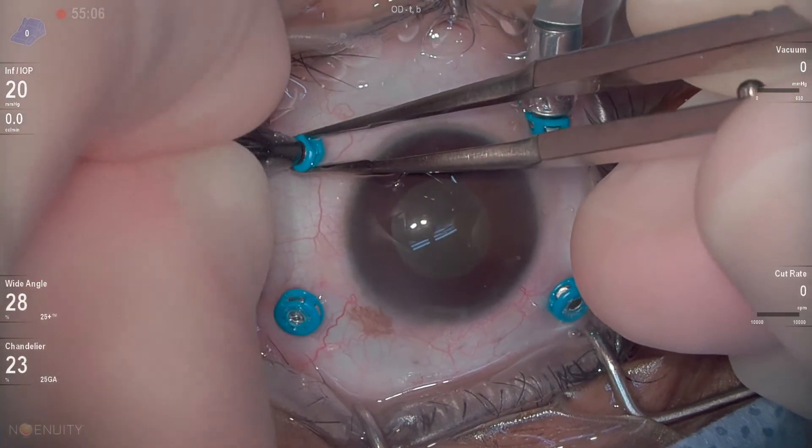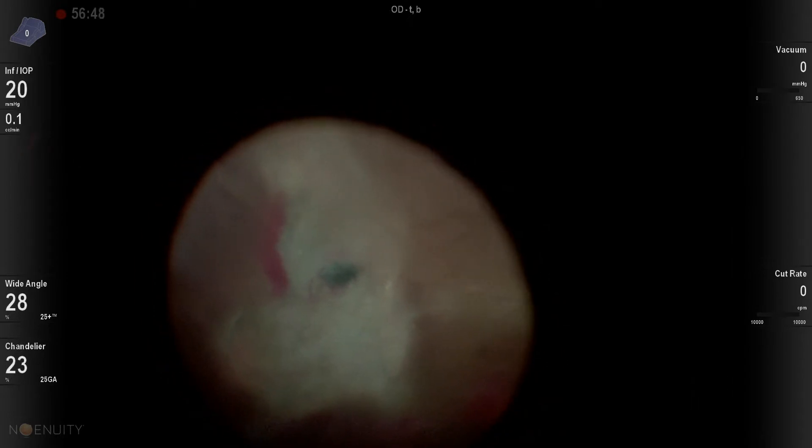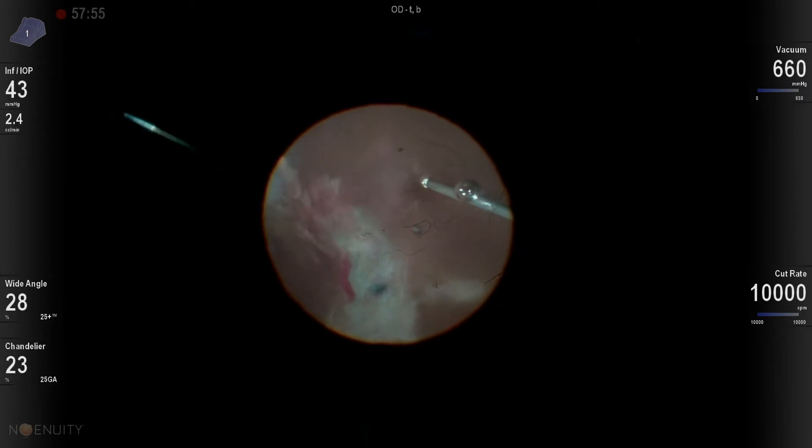Diabetic tractional retinal detachments are by far my favorite type of case, because they are just so diverse and different. This is a patient that had a really bad plaque across the macula.